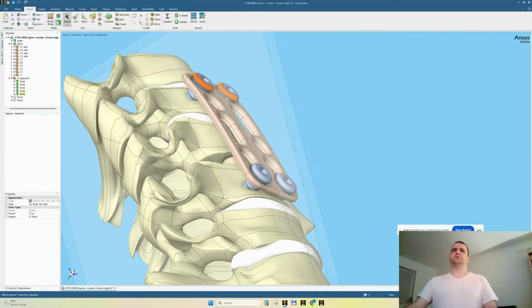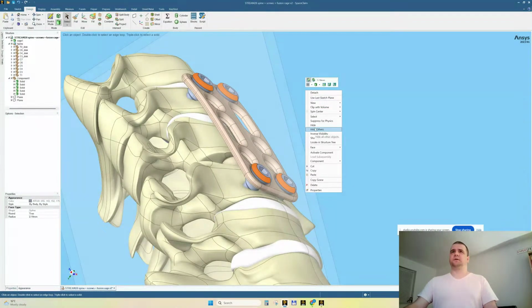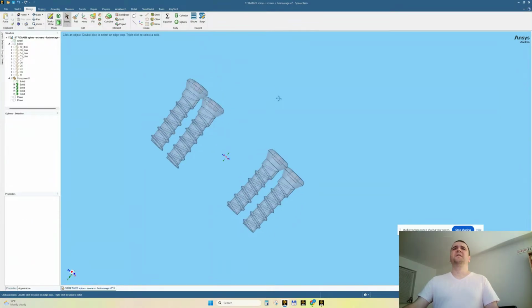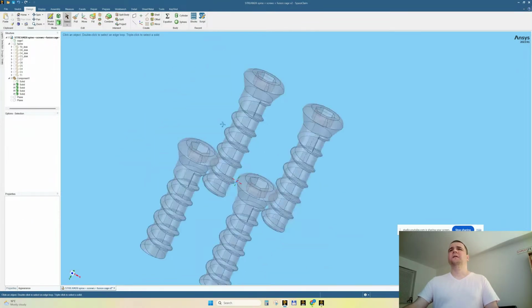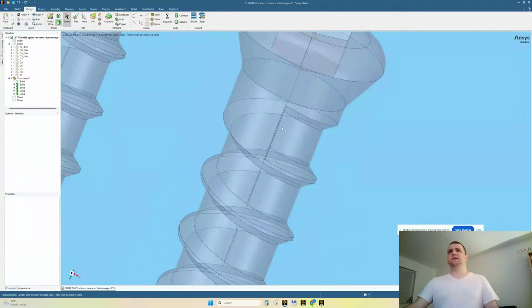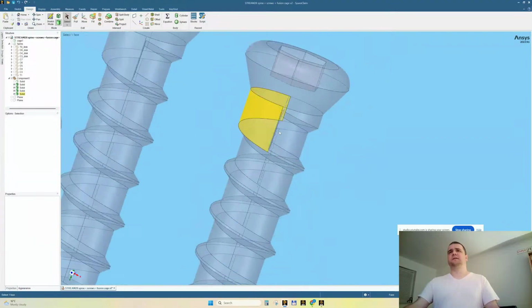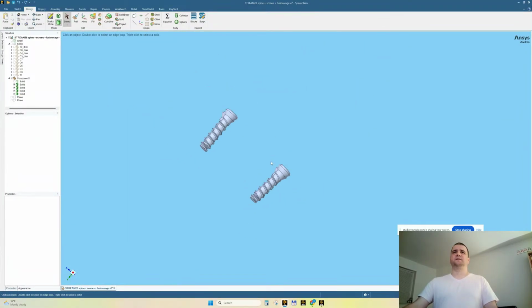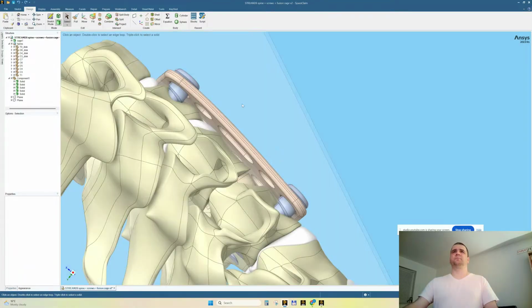There are some cavities which I think maybe they will pose some problems with the meshing. Let's make them transparent. Can I make them transparent? With Control pressed, we have here transparent. Oh no, it's no cavity. It was just the end of the thread, let's say. So everything is nice here. Let's move towards the Boolean operation.